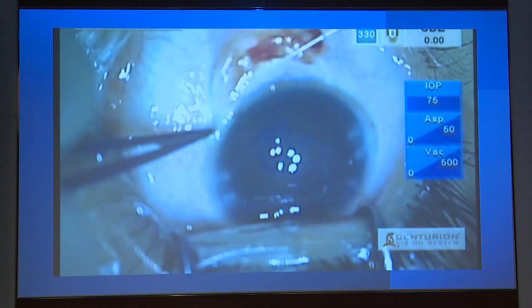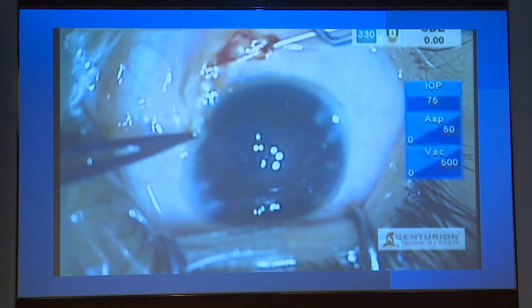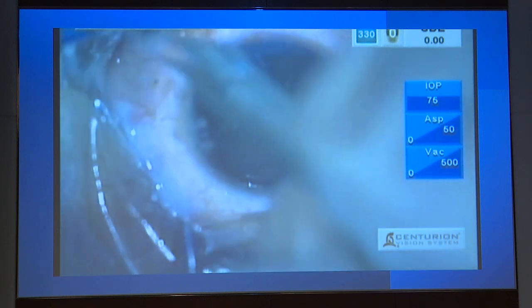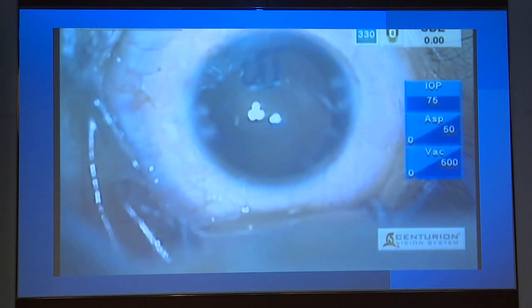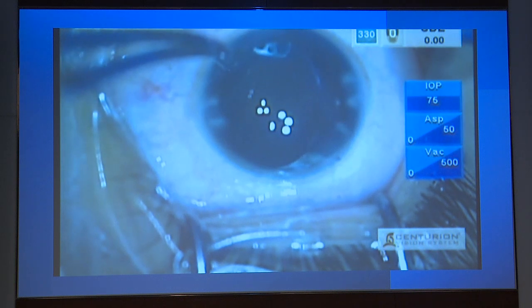And then we have to lock the suture in place by passing this needle twice through half thickness of sclera. With the needle, that's once. Once you tighten the suture after passing it twice through half thickness of sclera, then you simply tie it tight. This gives you a good capsular bag with adequate tension, which will hold an IOL. It gets buried inside the sclera itself.